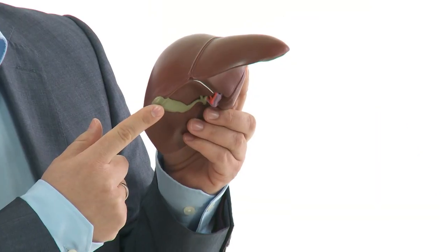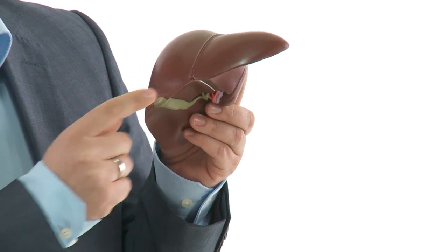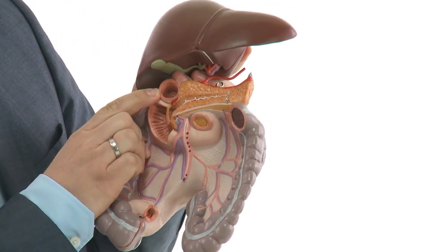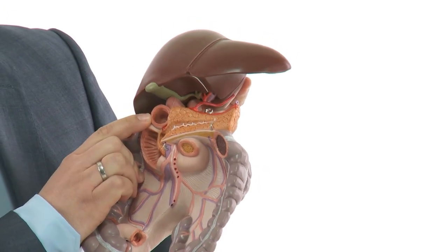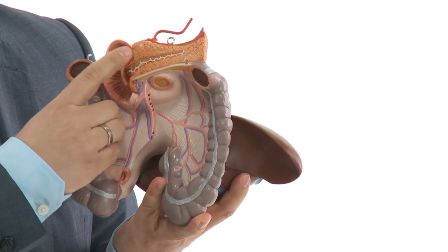The gallbladder is bordered by the liver, mostly segment 4, and by the bulbus of the duodenum, which you can see here. This regularly contains bowel gas, and sometimes it's difficult to distinguish between bowel gas and stones in the gallbladder, but more on this later. Also, the head of the pancreas is nearby.